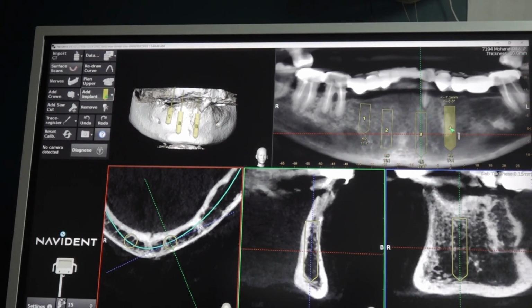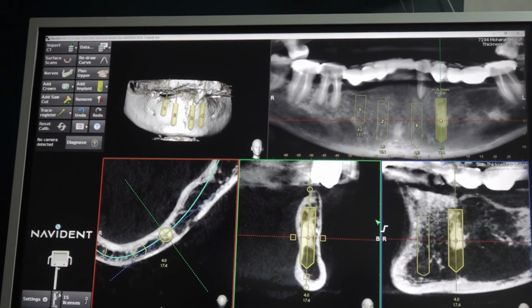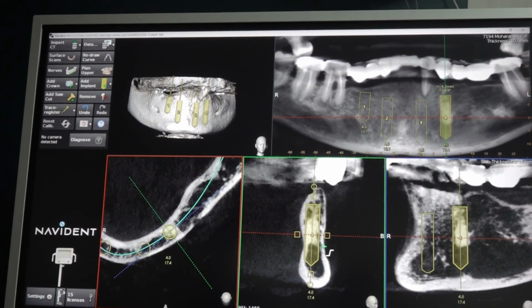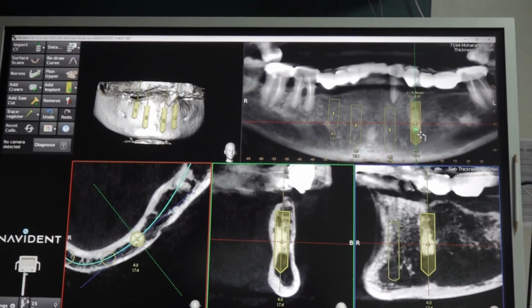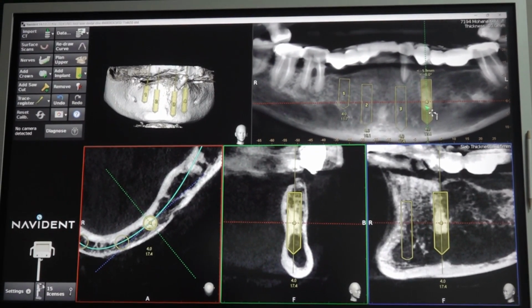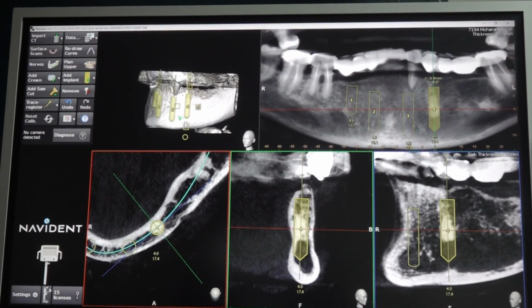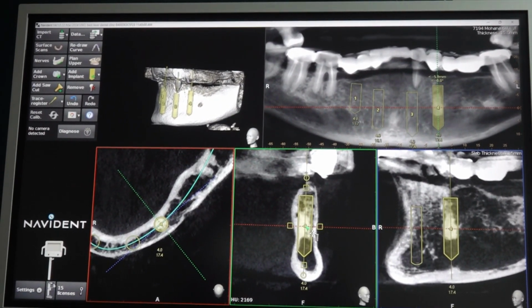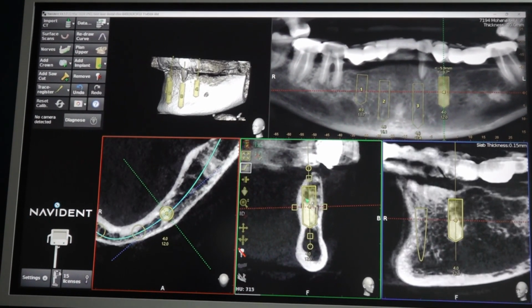Why are we using a thin implant here? Because the bone itself is very thin, there is a chance for bone resorption in the crest. So better to use it. Not only a thin implant, but with crestal threads, smooth surface. This is almost in the first premolar. The bone here is good, no? Some cortical bone is there. We don't have to go beyond this cortical bone, right?